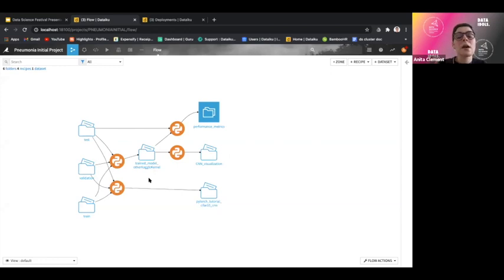But as I was saying, for now, we are still in this development design environment. I can give access to this project to some of my colleagues, but it still makes it quite difficult for them to really use it. So the best solution in these cases is to move that project, that model from this design environment to the API node.